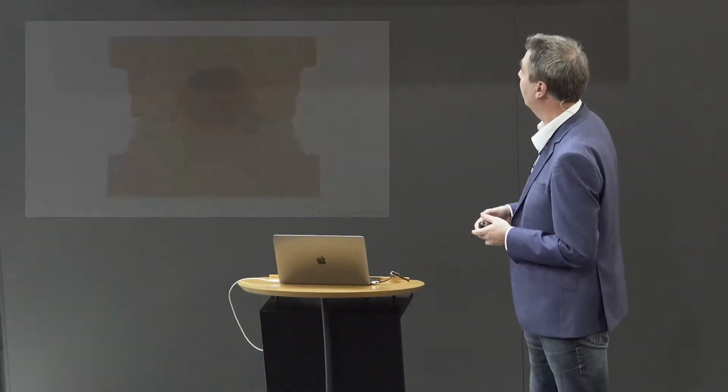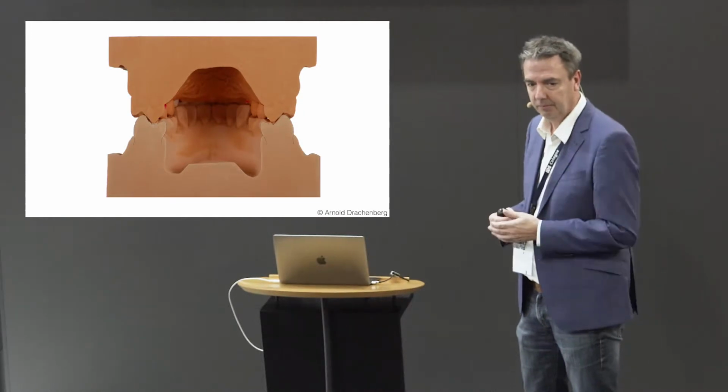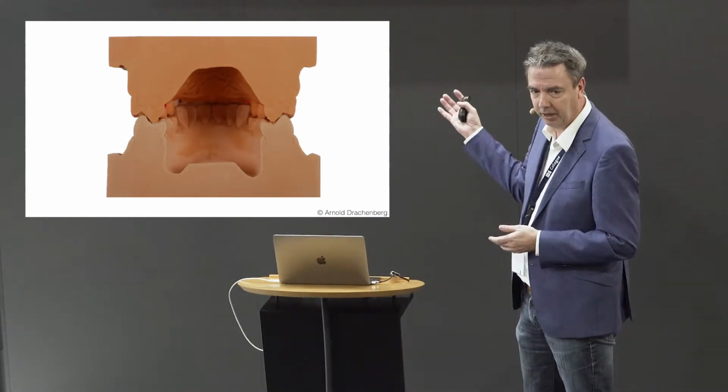So, now let's talk about minimal invasive preparation, because this is my favorite thing in dentistry. I always try to preserve the tooth structure of the patient. I always try to be as minimal invasive as possible. That's a key point. And this is a picture, Jan, you know him very well, from Arnold Drachenberg.